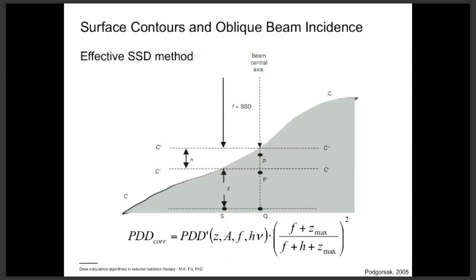So this would have the right depth set, but this is still assumed that the PDD starts at C double prime. So it would be starting from here, going to the depth set. What this method is doing, it's shifting the depth dose to this location. So it would account for the right attenuation and the right depth.